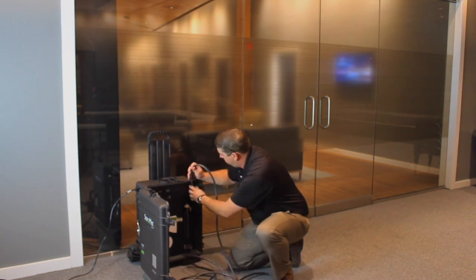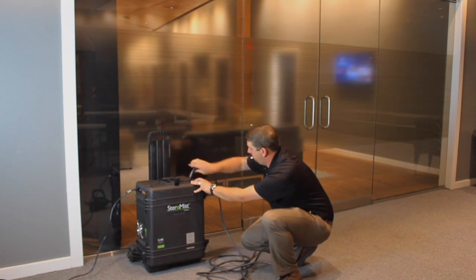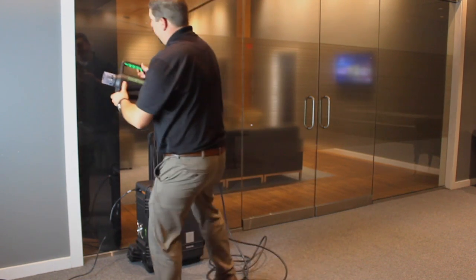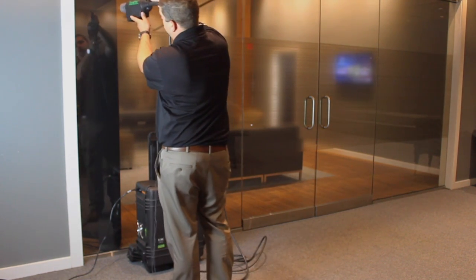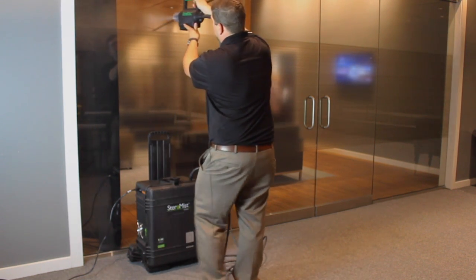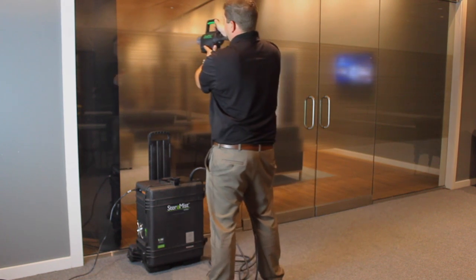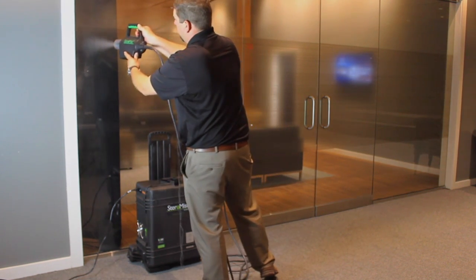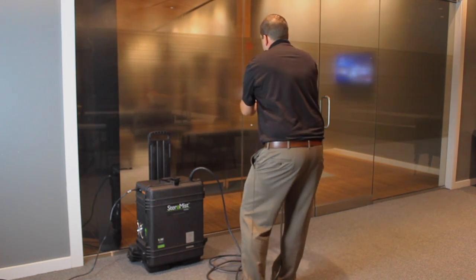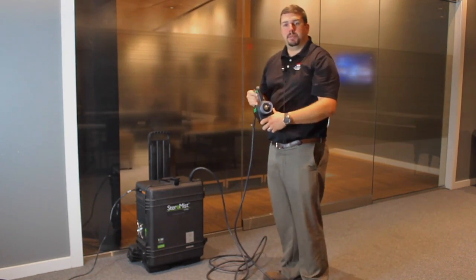We'll close this up. When you're applying, you want to hold the applicator 18 to 24 inches away from the surface being applied to. Pull the trigger and start applying. Be careful not to overlap too much — more product doesn't mean it's doing a better job. You actually want to have a steady, even coverage. It's as simple as that.